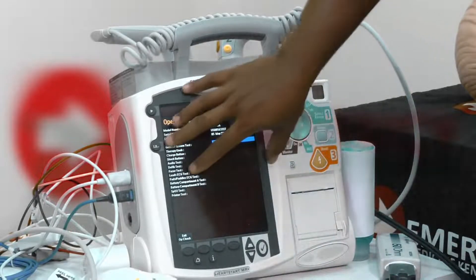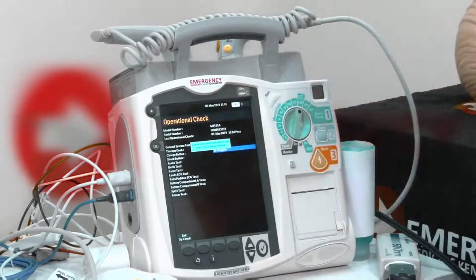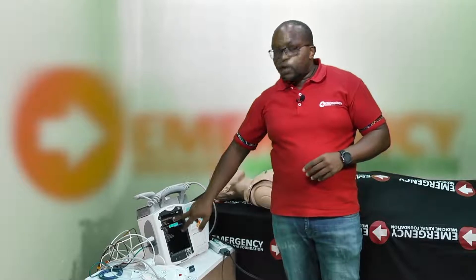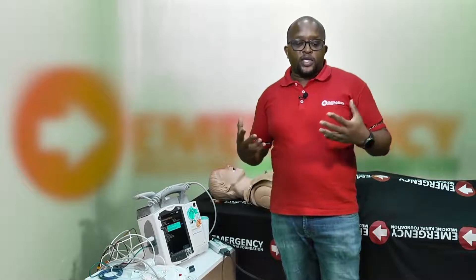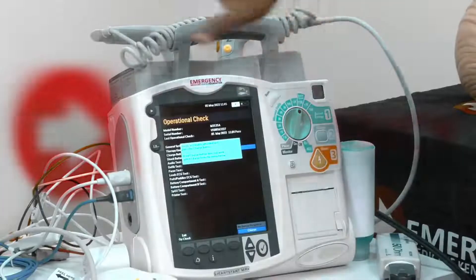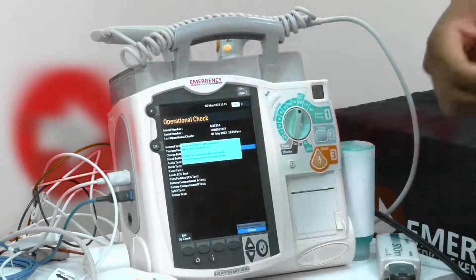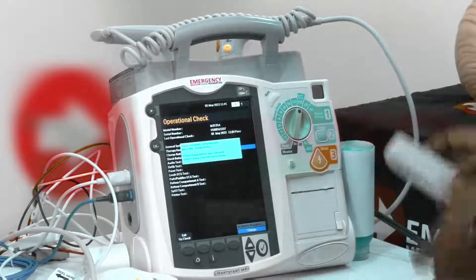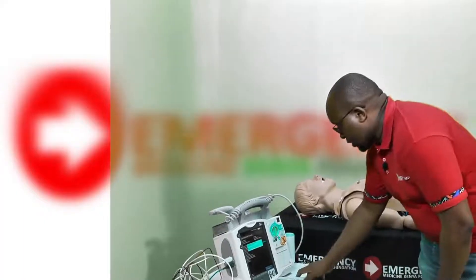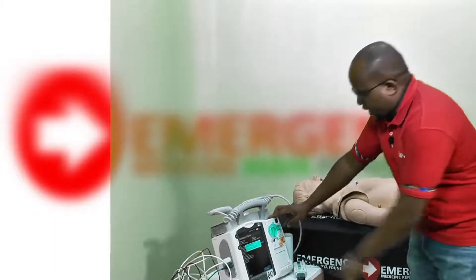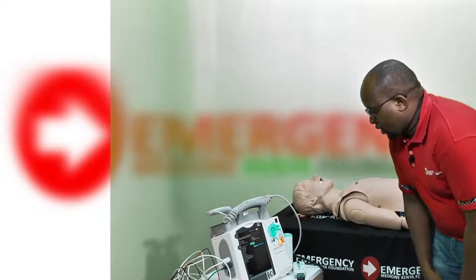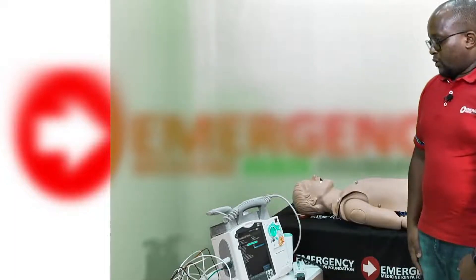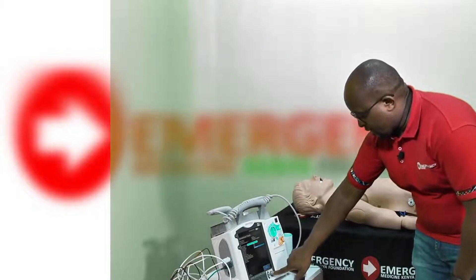This record is important — if a machine stops working during defibrillation you can go back and see when it was last checked. This has been used in medical-legal cases where someone claimed the defibrillator didn't work, and the system showed it hadn't been checked in two weeks, making the clinician liable. The screen now prompts to press the charge button, then press the shock button — shock delivered — and I acknowledge.